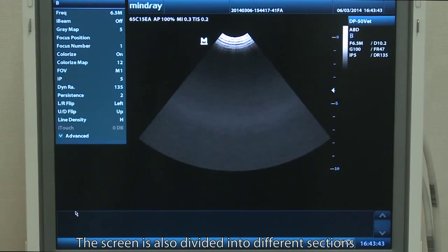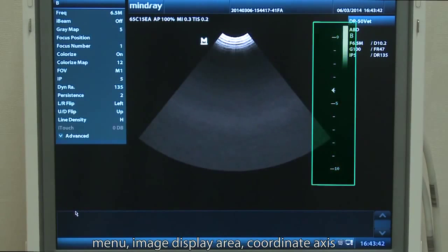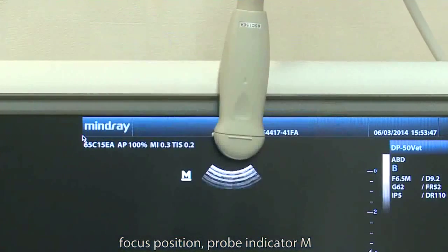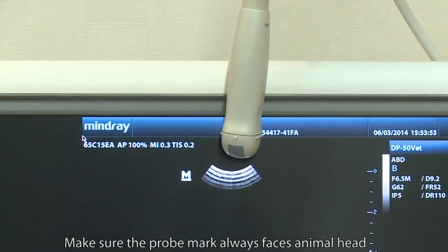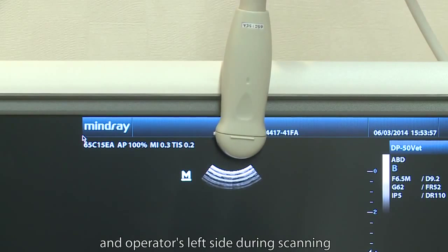The screen is also divided into different sections: menu, image display area, coordinate axis, focus position, and probe indicator M. Probe indicator M corresponds to the position of the probe mark. Make sure the probe mark always faces the animal's head and the operator's left side.